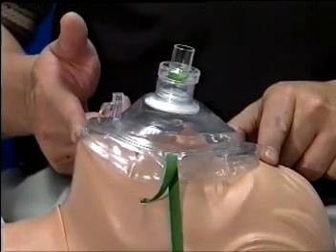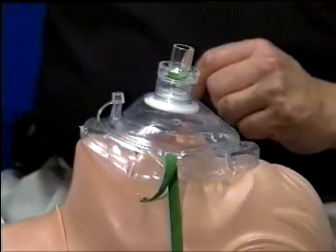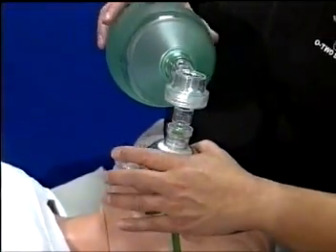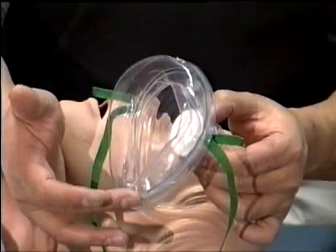When advanced care arrives, there is no delay in starting advanced resuscitation procedures due to the 15mm round rescuer mouthpiece that affords attachment for a bag valve mask and oxygen powered resuscitation devices.